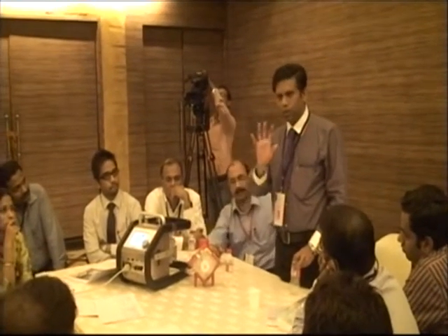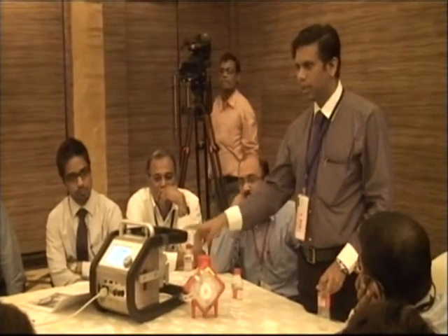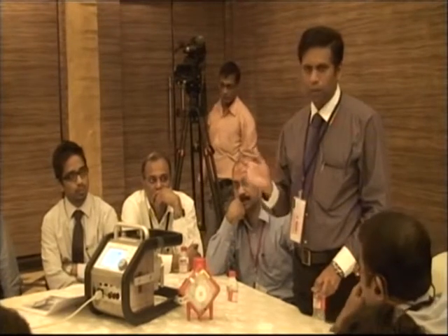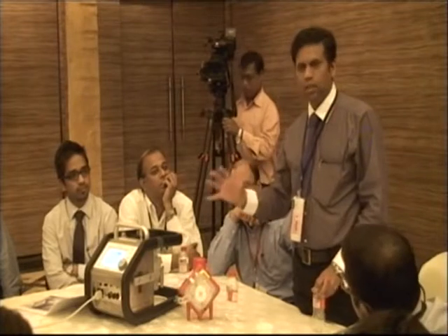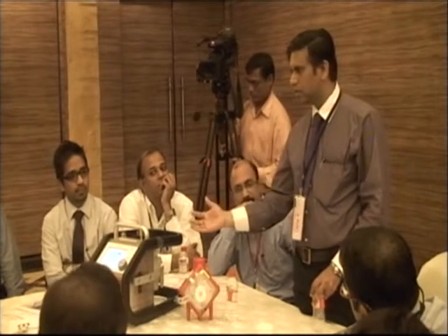This machine, we take out the blood from the patient's right atrium, we send it to this machine, it oxygenates it, rewarms it, and pumps the blood back to the patient's circulation. It maintains the required amount of blood flow, maintains the cardiac output, and we sustain this patient for some days. The usual time limit that we try to achieve is around 30 days, and we can give this much time for that pathology of the lung to recover. And once the lungs recover, we can slowly discontinue this.